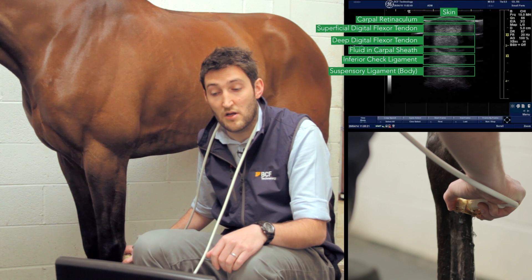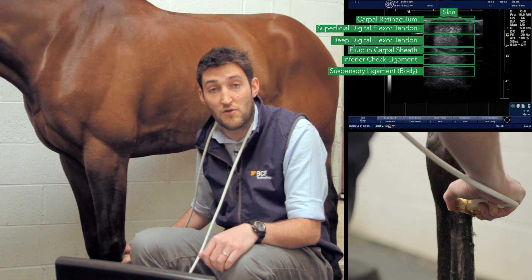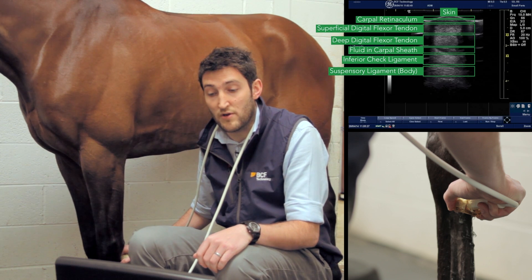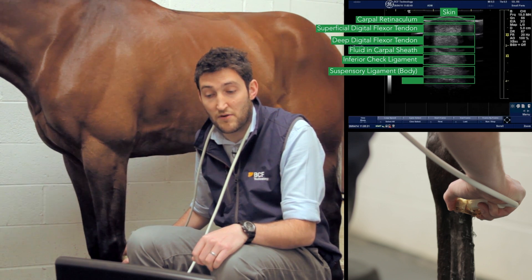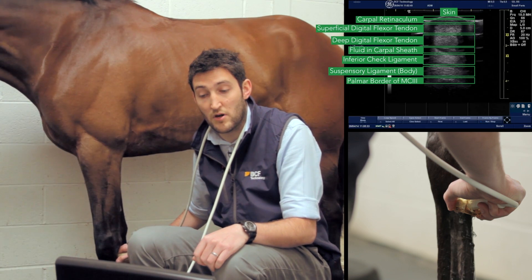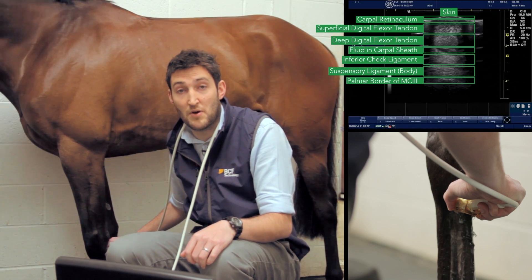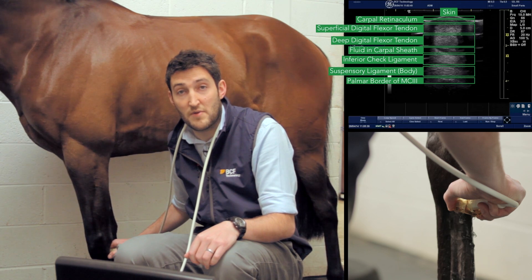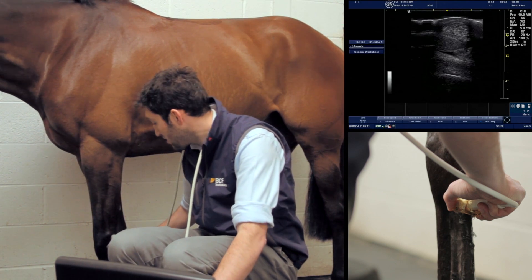Below the check ligament is another roughly rectangular structure — the body of the suspensory ligament, quite close to its proximal origin. The last thing visible at the bottom of the image is a thin, bright white line representing the palmar surface of the cannon bone, or third metacarpal bone. We then unfreeze the image.